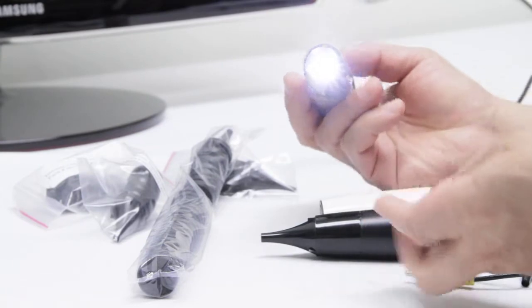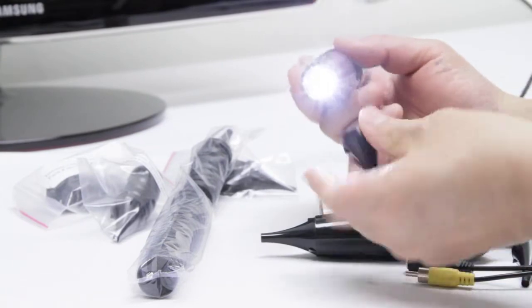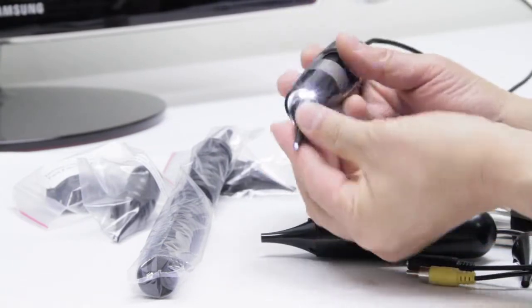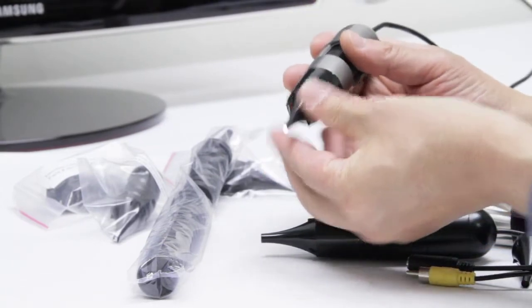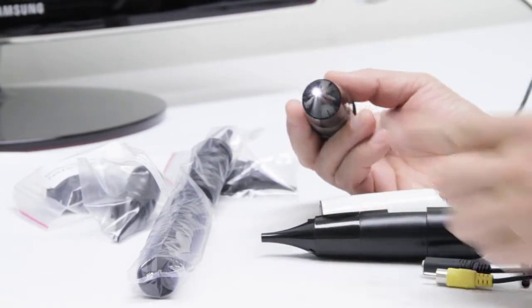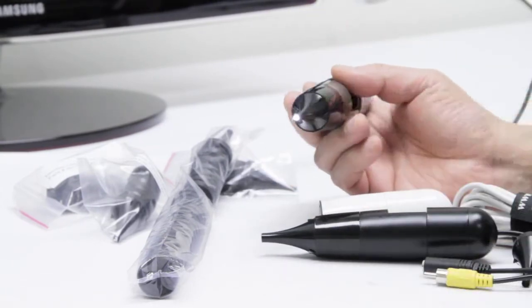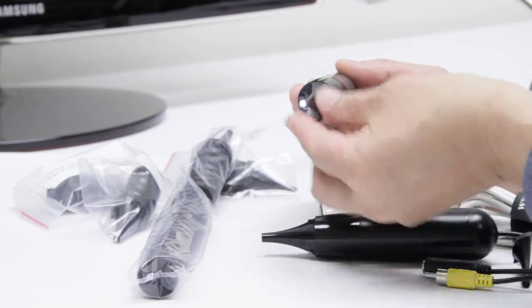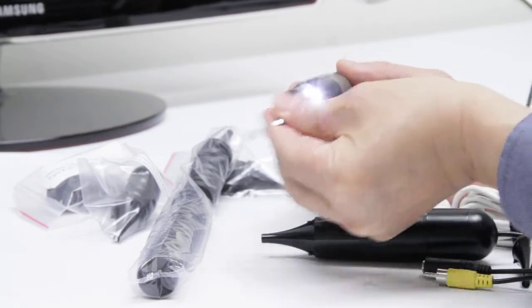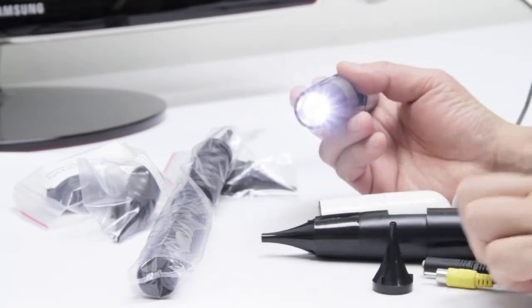The LEDs provided on the otoscope are clustered closely together. This is to ensure that adequate light passes through the small hole in the ear specula.